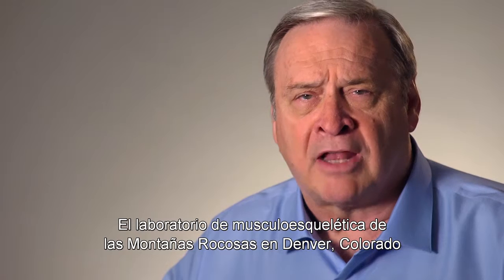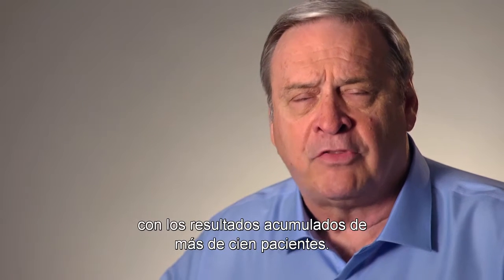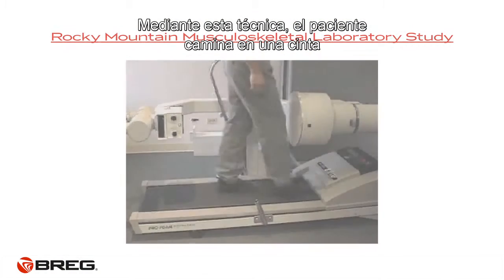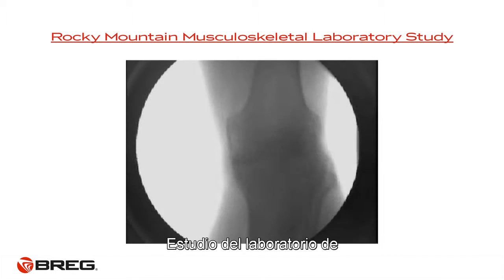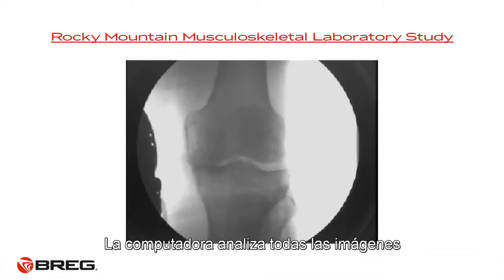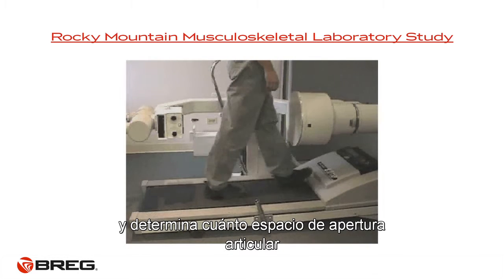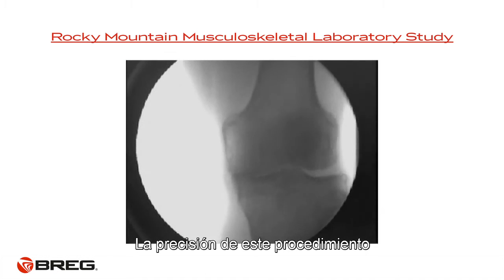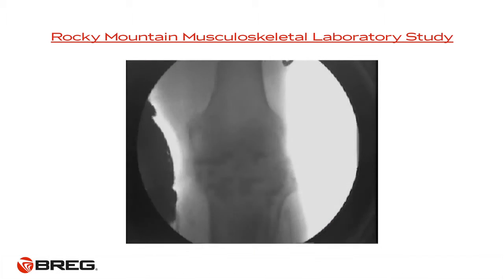The Rocky Mountain Musculoskeletal Laboratory in Denver, Colorado, performed and published several studies with the cumulative results of more than 100 patients. This technique involves the patient walking on a treadmill with a video fluoroscope, both with and without a brace. Video images are then downloaded to a computer for analysis. The computer analyzes all of the images and makes a determination of how much joint space opening is present in the knee before and after bracing. The accuracy of this particular procedure shows that the error is less than 0.4 of a millimeter.